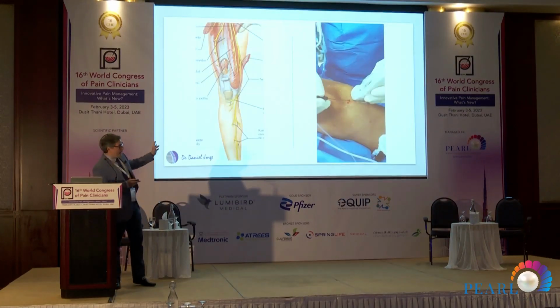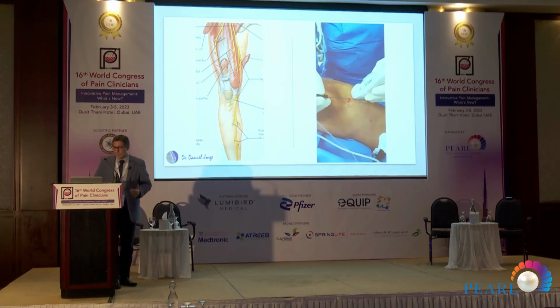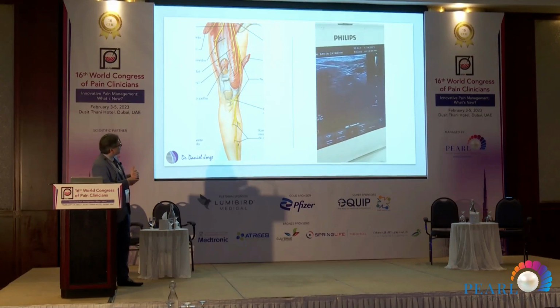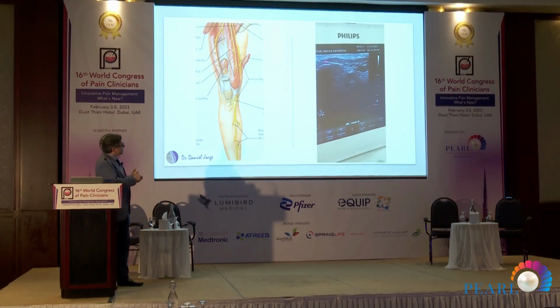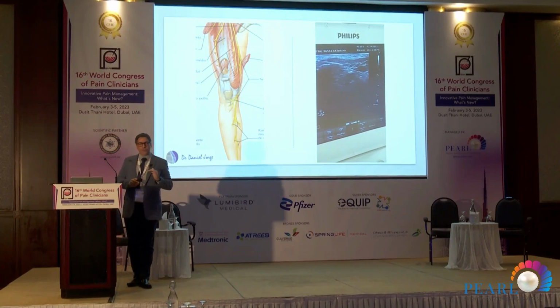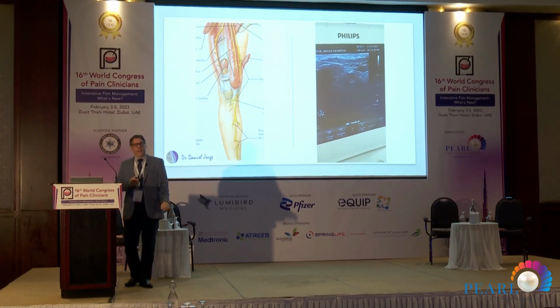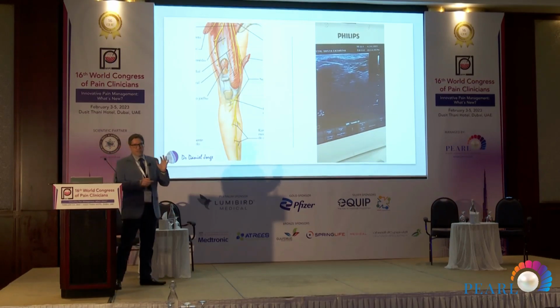It's an X-ray guidance paper. As I am an ultrasound fan, I adapted it to the ultrasound, and it goes like that. Because actually you can see here the patellar tendon and the end of the patella bone, and you just put your needle under your tendon going from medial to lateral, and you can make your procedure safe and sound.